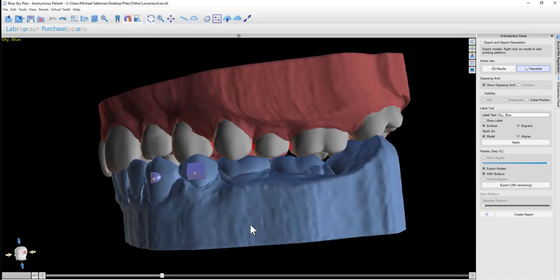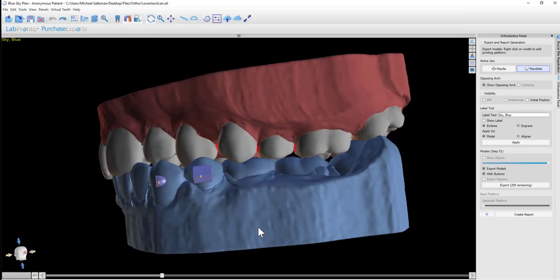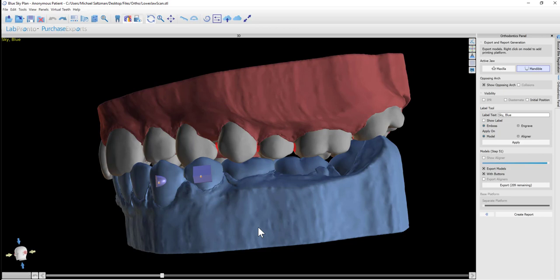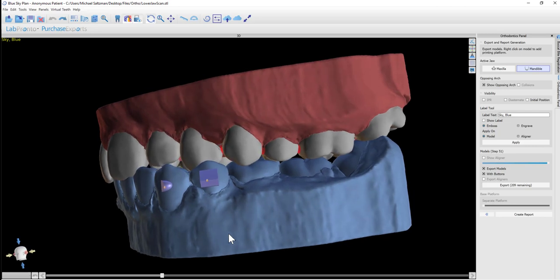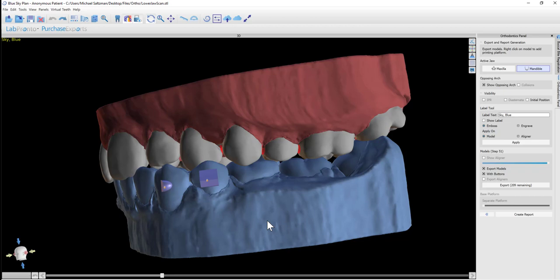Before exporting the models, it's important to do two things. Number one: it's important to add label text, which will either have the patient's name or a unique identifier, but it will also include the step number so when the models are printed you'll be able to identify which model is which and the correct order. The second thing is to add a base for vertical printing.